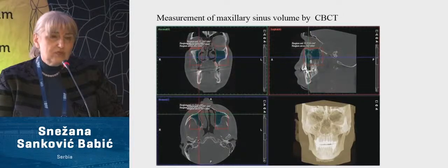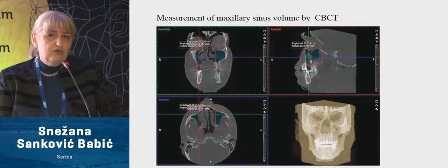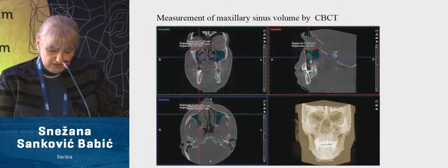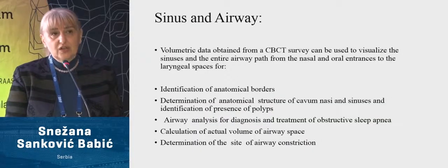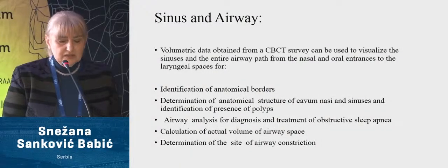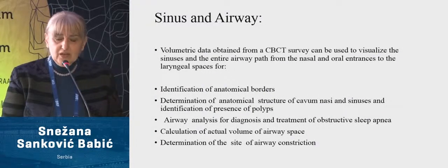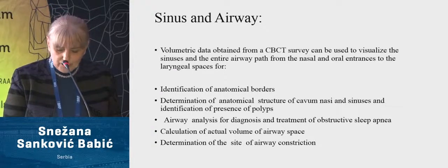What is more, sophisticated software enables us to measure precisely the volume of the aerated spaces of the nose and nasal sinuses. It is actually a new diagnostic tool. It is very useful, as confirmed by recent studies, first of all for the diagnosis and treatment of obstructive sleep apnea, and for precise determination of the site of airway obstruction.